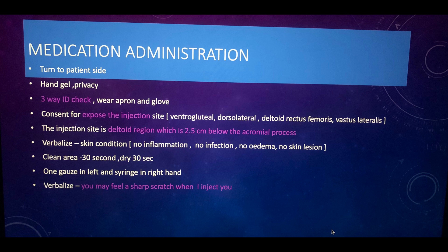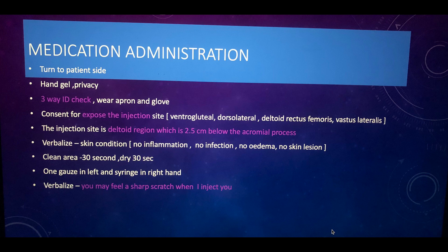Visually inspect and verbalize the injection site: no inflammation, no infection, no edema, no skin lesion — skin is clean and intact, so you are happy to proceed. Then verbalize that the injection site is the deltoid region, which is 2.5 centimeters below the acromion process. Use your knowledge here to demonstrate that you know the correct landmark for the injection site.